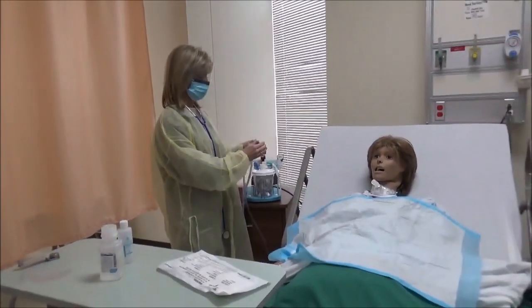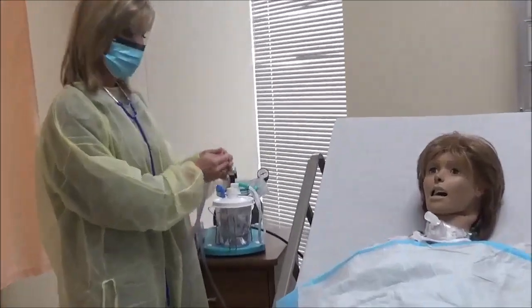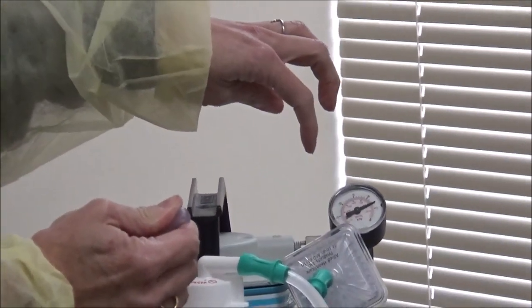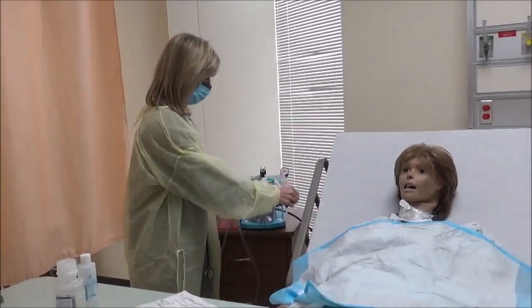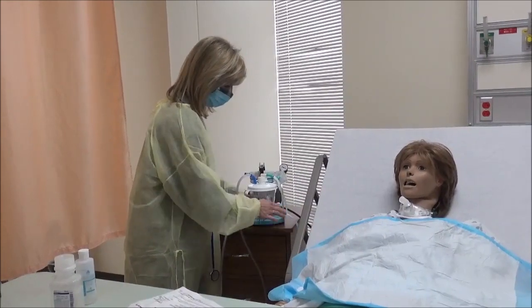I could also pinch the tubing and do the exact same thing. But again, when you pinch it, you have to hold it there for a minute to see what the actual maximum pressure is that's going to be applied. So I know my suction is working. I know that my pressures are set at the correct amount. So for right now, I'm just going to turn this off and have this readily available.